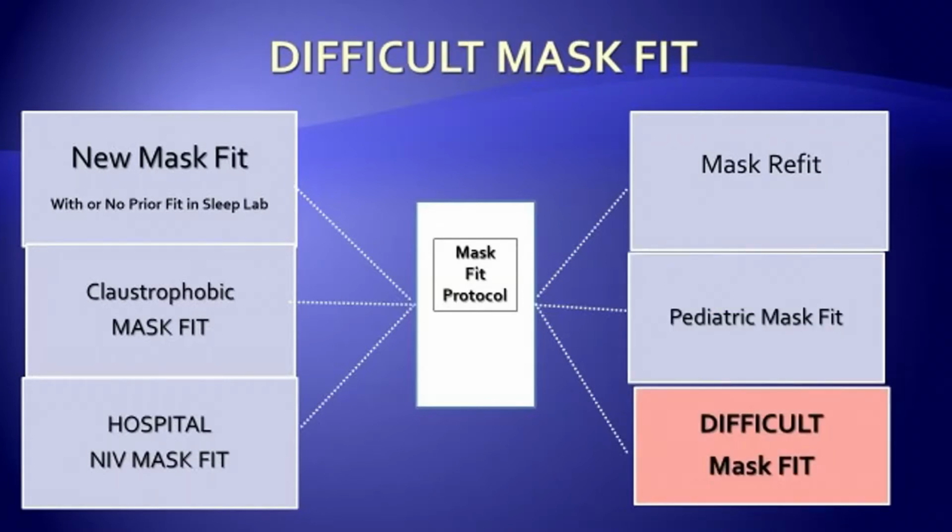Finally, the last situation I'd like to show you is the difficult mask fit. I call it that because basically we have a patient who is on a high pressure, could be 30, he could even be on a ventilator, 35. The mask doesn't fit. They've had 3 or 4 previous failures, and usually there are facial irregularities that create leaks by themselves, but the high pressure exaggerates that. So getting the fit is absolutely important, but it's overcoming these obstacles and doing that.